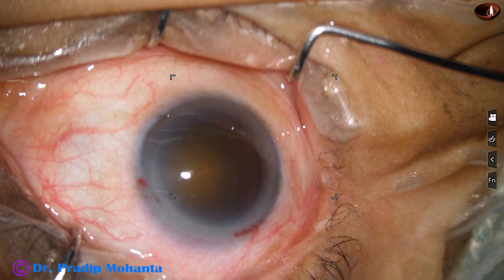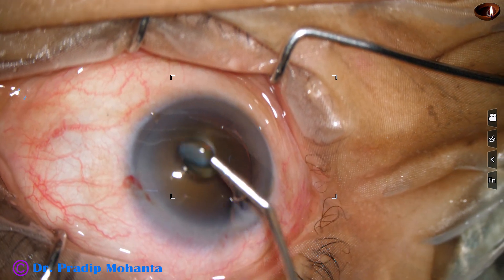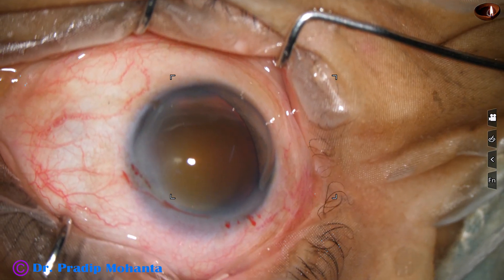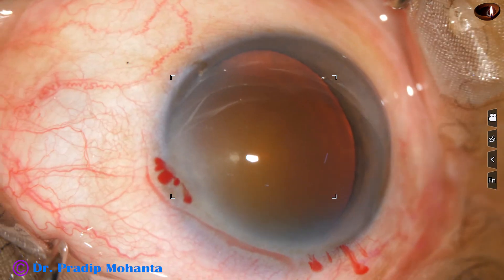Though the cataract is very hard in this case, the nuclear sclerosis is about grade 5, but we are having fairly good red glow. And so I decided not to stain the anterior capsule.